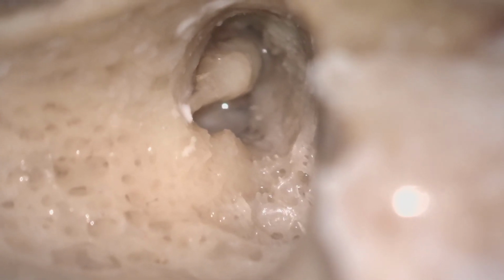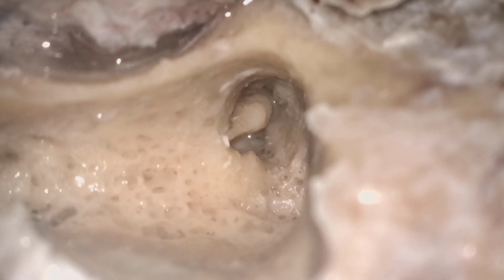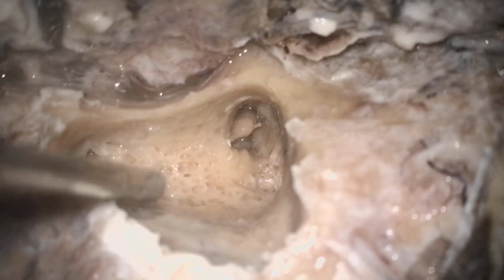If we remove the malleus and the incus, then the anterior part, the cog, is clearly visible completely. Okay, so this is the actual epitympanotomy. You can go up to the eustachian tube from that direction also, but we are not going so far at that position because you have to start dissection today, and we will demonstrate the key steps only for your ease. This is the cortical mastoidectomy.